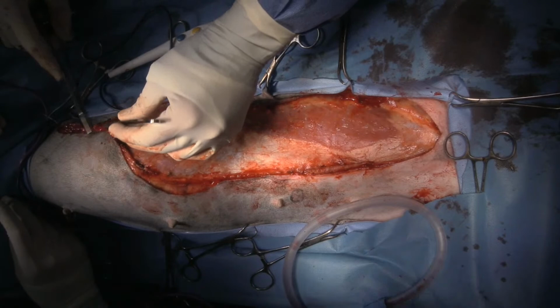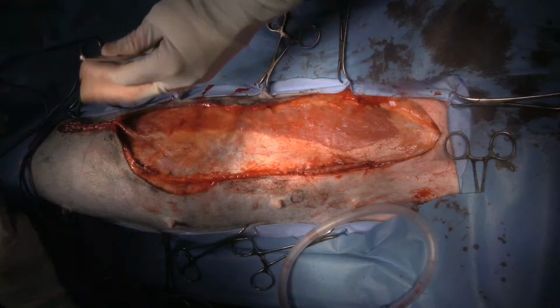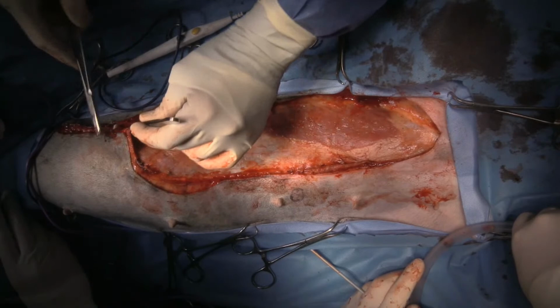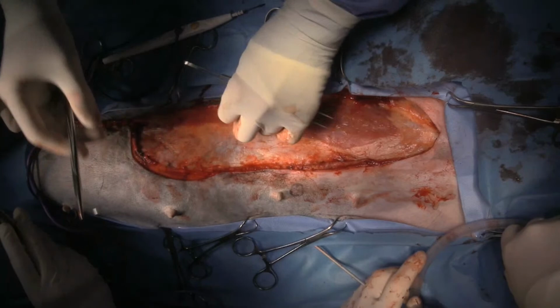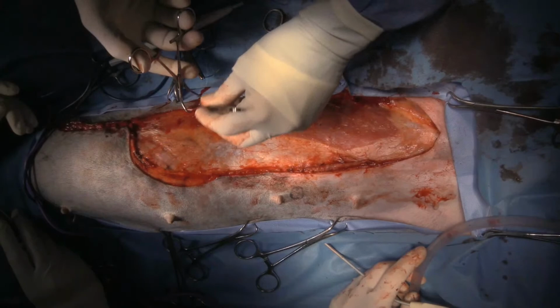And this definitely does not need a drain. I am tacking it down to the underlying tissue periodically. What's your opinion on doing tacking? Someone once told us that it can be quite potentially uncomfortable. So the question is, what do I feel about tacking? I think it's a good idea, and while it can be uncomfortable, I think that a seroma or dehiscence or whatever could also be uncomfortable. So I would probably do it.